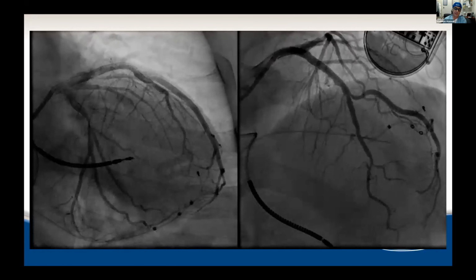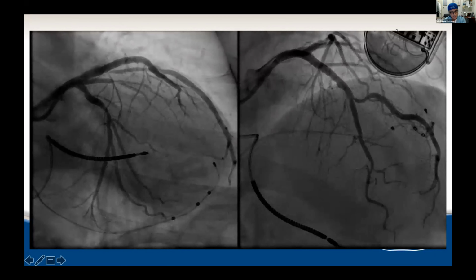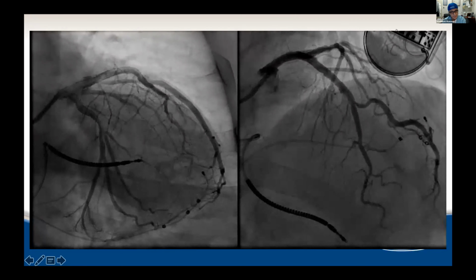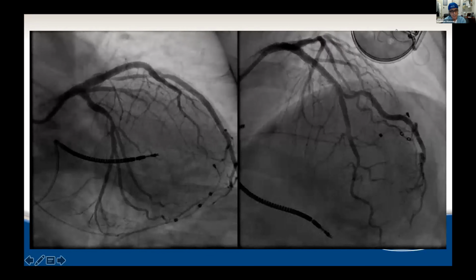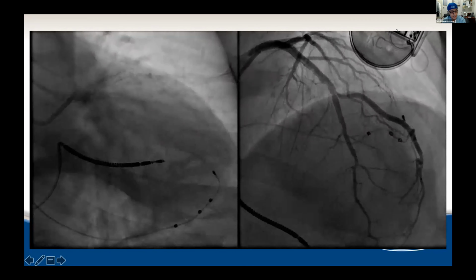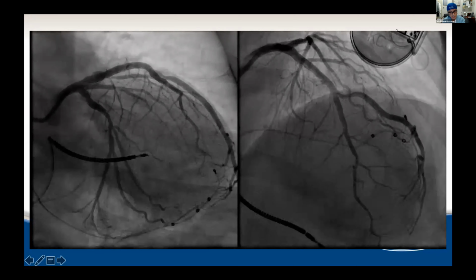Yeah, nowadays with IVUS, we face this problem. You put a balloon, you expand the stent, you take the balloon out, and the stent recoils again. I'm yet to know what to do about those, because you face them more in the proximal circ than other vessels. With IVUS, if you have a 5.5 lumen, you should be okay, although we just had a patient who didn't do okay despite the 5.5. I don't know the answer. Like, a 4.5 millimeter balloon, another 4.5 millimeter balloon, and it does expand it. Should I use a 5 millimeter and shred the vessel open, or would Shockwave work in this situation? I really don't have the answer to that yet.